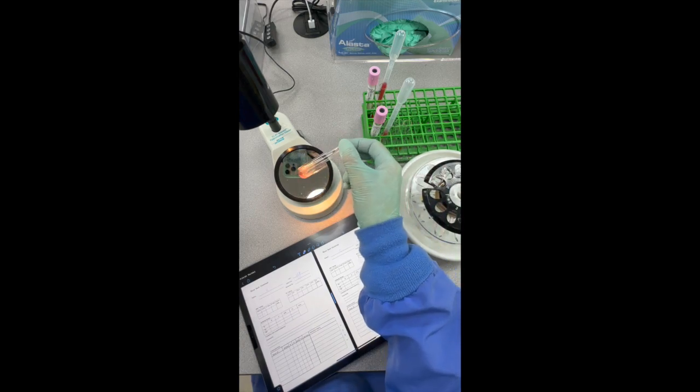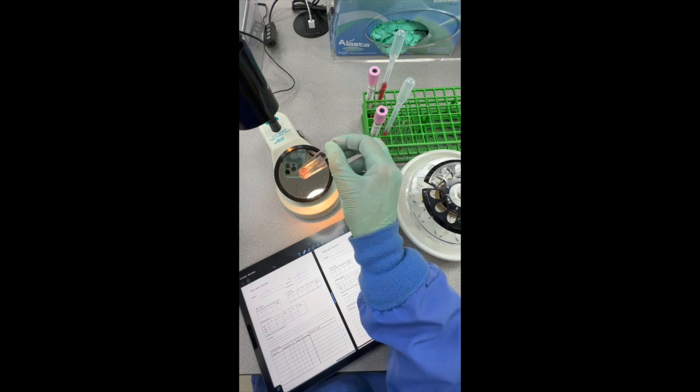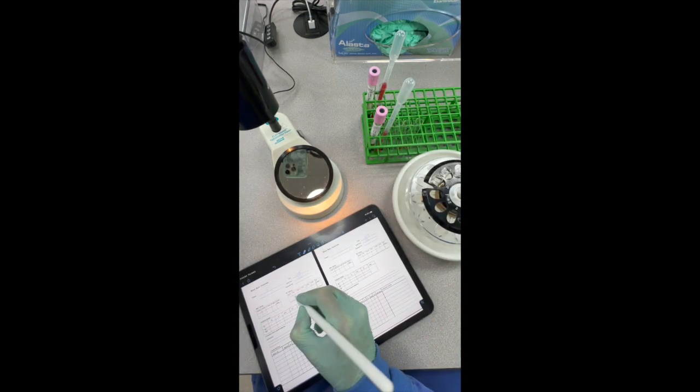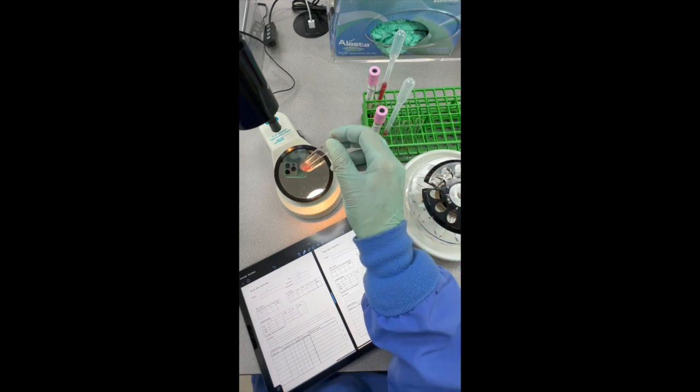Shake and tilt. I'll tilt that for you, and you can see it's just streaming right off of there. Really nice negative there. Okay, for our D, write that down. Our D control, or our RH control.